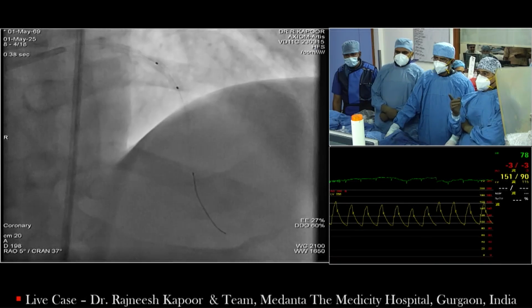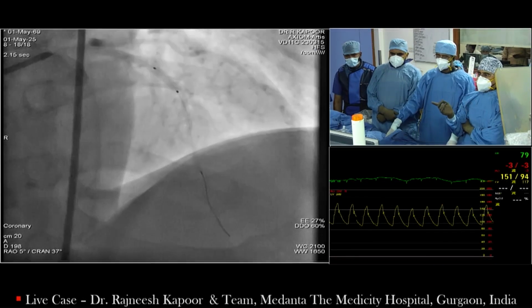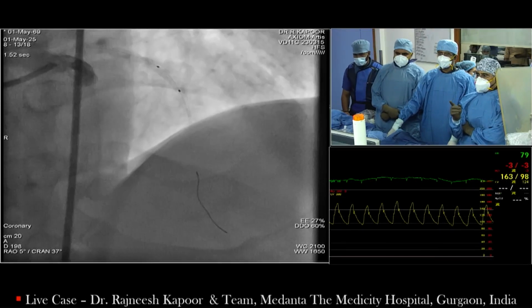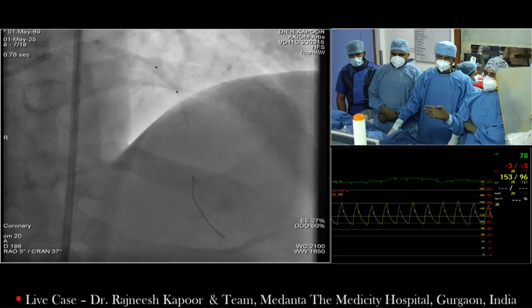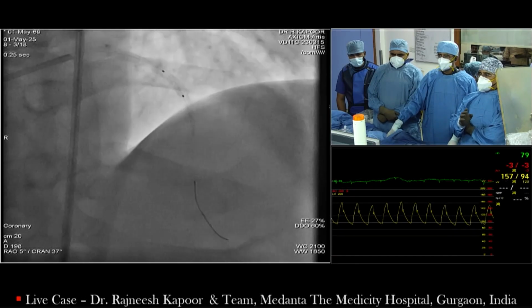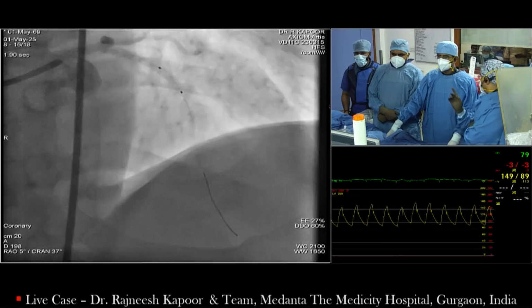Then, you know, we have to change it to a Viper wire. So we were planning an orbital. We were prepared for orbital. We didn't expect a non-crossable lesion here. We thought we'd pass our Viper wire easily and do the orbital to the whole segment. And then obviously after the modification, we should be better off with the vessel and stent it.